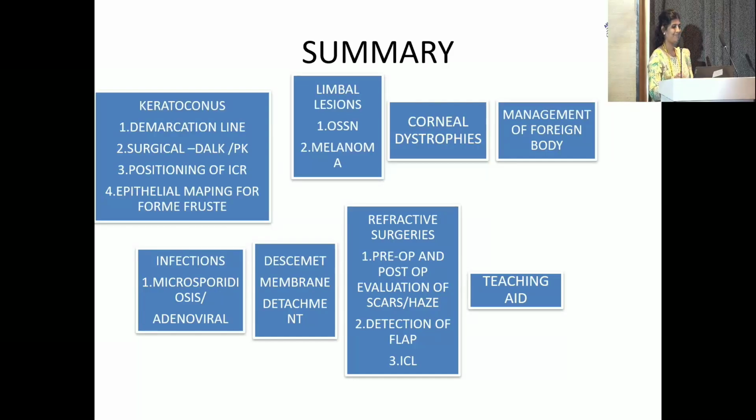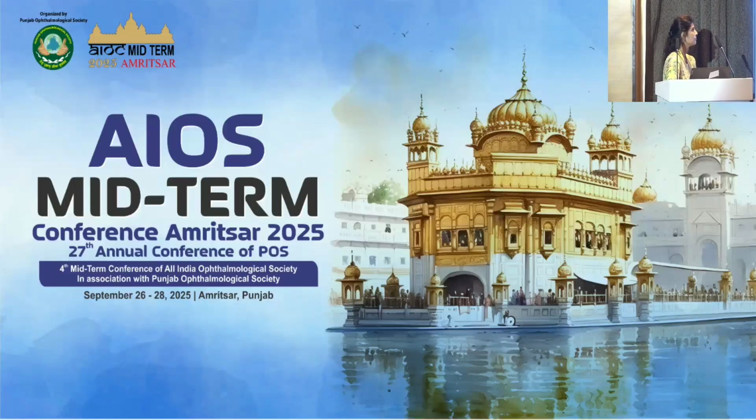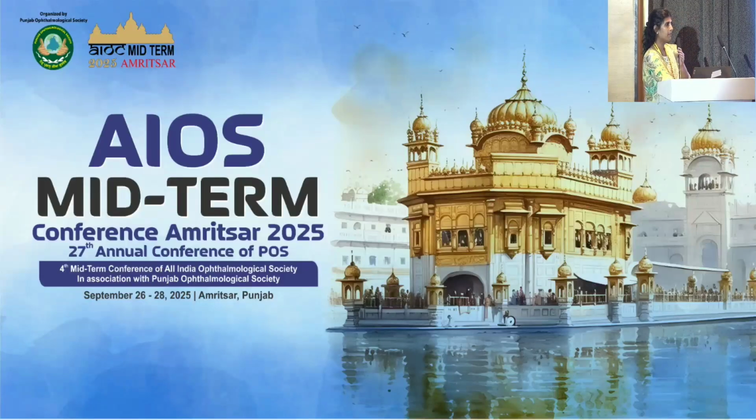Thank you very much, Dr. Deepti. I just have one question. Usually our gastro friends send cases for us to look for KF ring. Does ASOCT help in KF ring? I remember reading an article that there are certain changes in the time domain, maybe in the higher end, maybe the swept source or whatever, that SD we can use, but I generally use this Topcon.